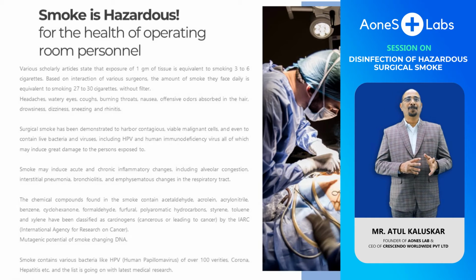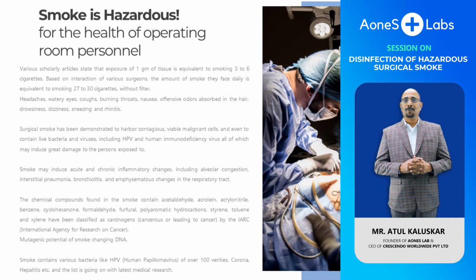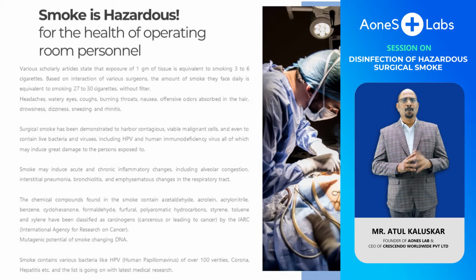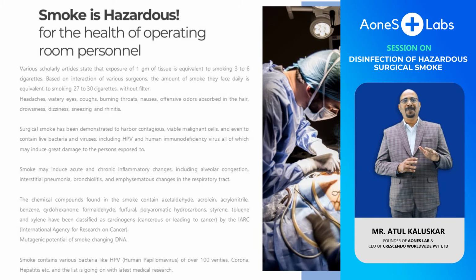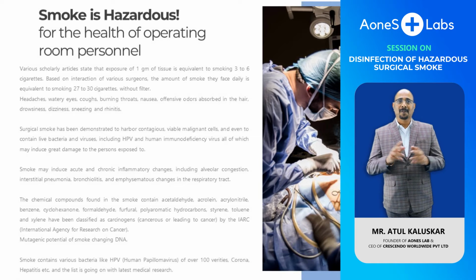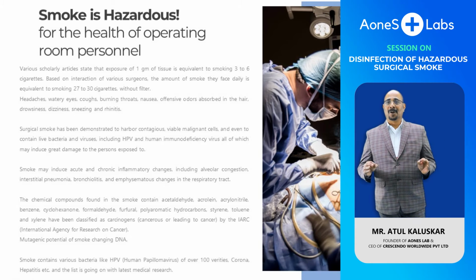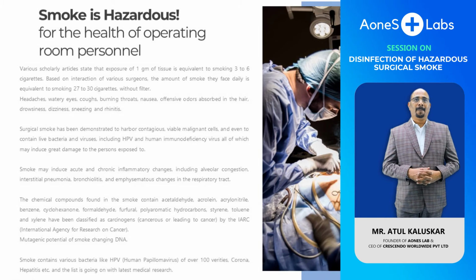Therefore, surgical smoke is a term used for several gaseous byproducts produced by energy-based surgical instruments. It is also known as plume, cautery smoke, cautery plume, diathermy plume, smoke plume. Most of these terms are often used interchangeably. However, the term smoke, although not formally correct in all cases, is used to describe these surgically generated gaseous byproducts which are hazardous to the OR or OT team.